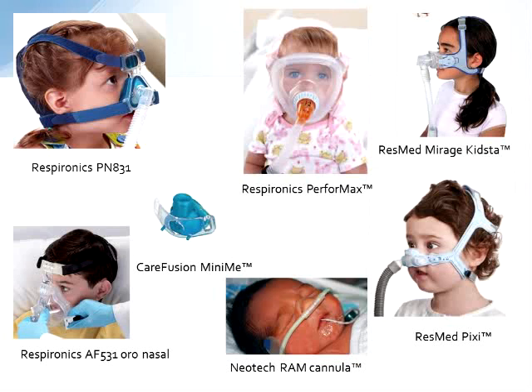It also seems to ease fears for our patients. It looks a little bit more, again, quote unquote, normal, less invasive, if you will, and they tend to be a little bit more compliant with it. So I'm looking forward to that. It certainly doesn't work for everyone, but it's nice to have another tool in our belt, given that really there just aren't a lot of options available for our small patients.